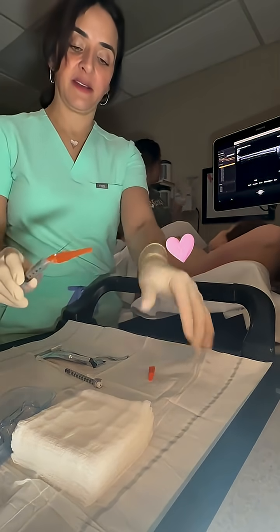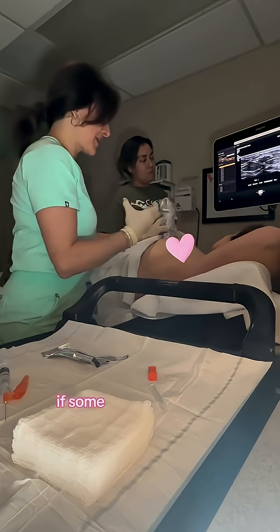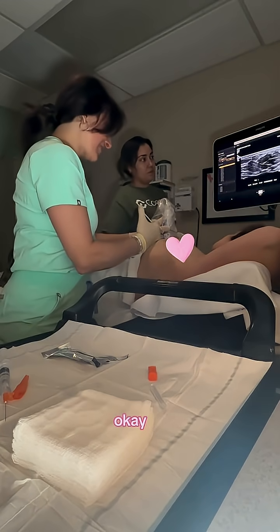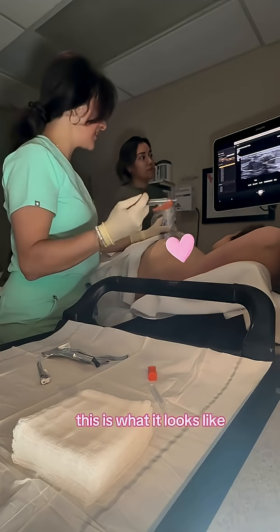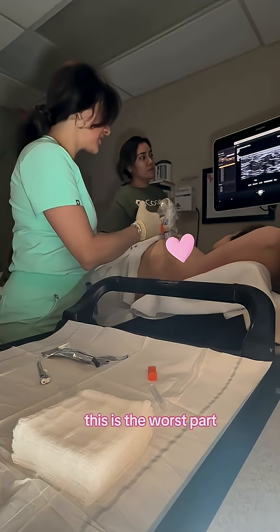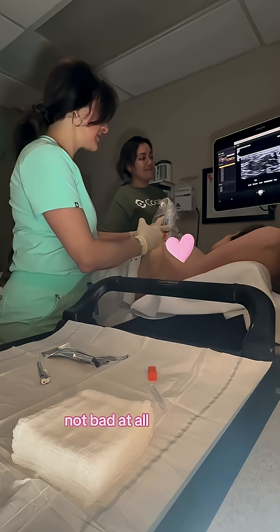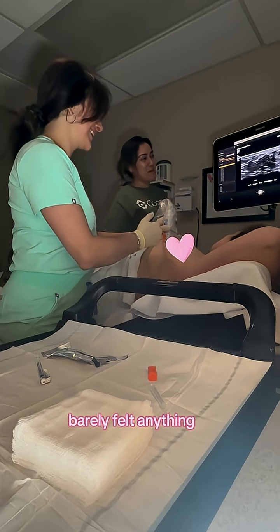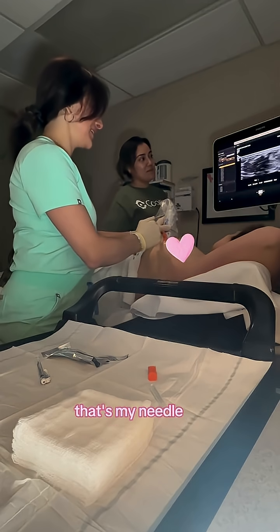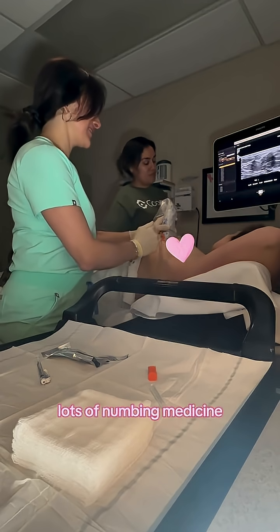So this is our numbing medicine. Getting all this right up, give some numbing medicine. It's going to feel like a pinch and a burn. Ready? One, two, three. Give you a little bit more numbing medicine. This is the worst part. Not bad at all — you heard it here first. Barely felt anything.